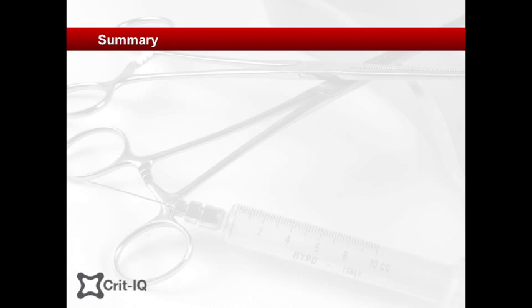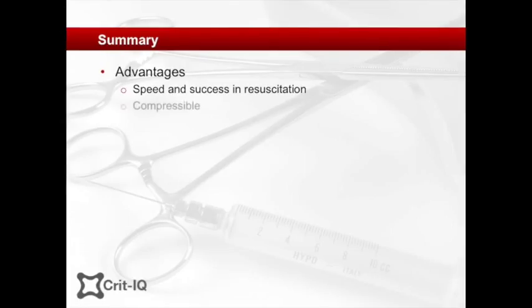In summary, the femoral approach has the following advantages and limitations. Advantages include speed and success in resuscitation situations, and lack of risk to supradiaphragmatic structures.